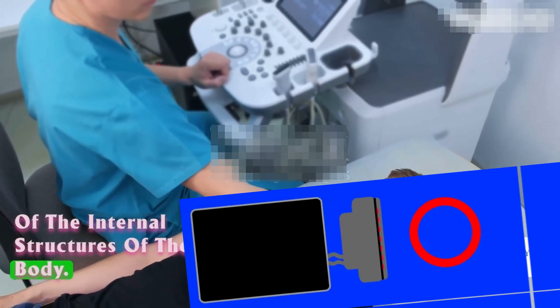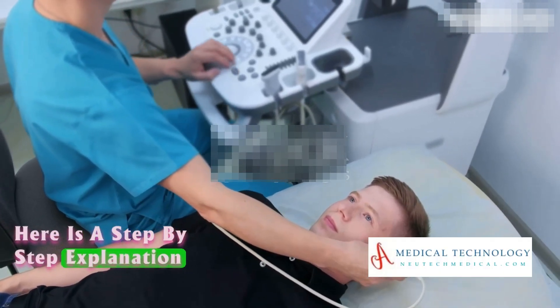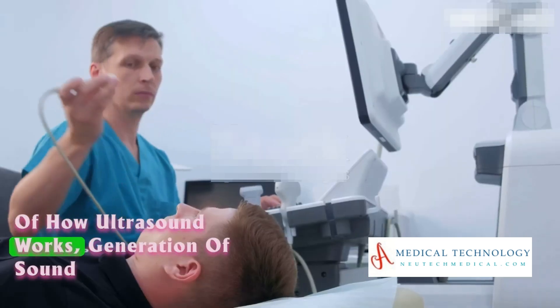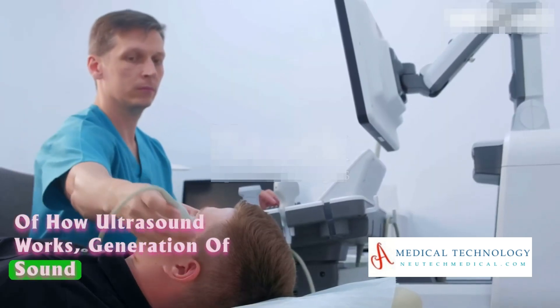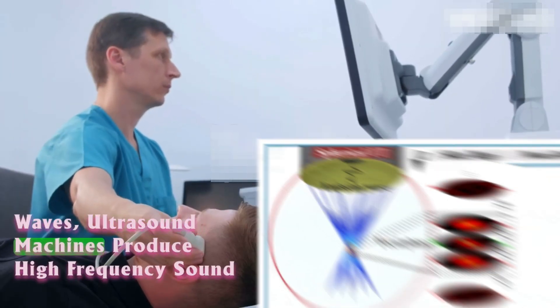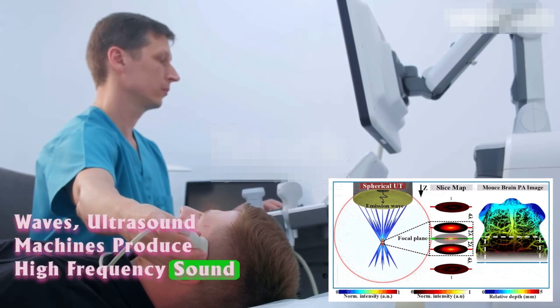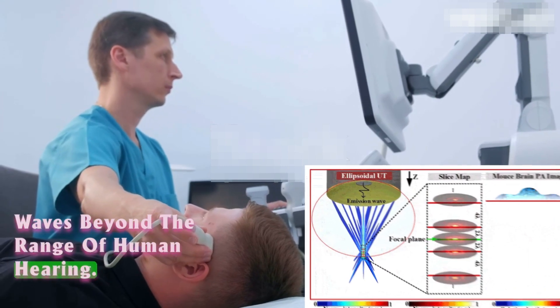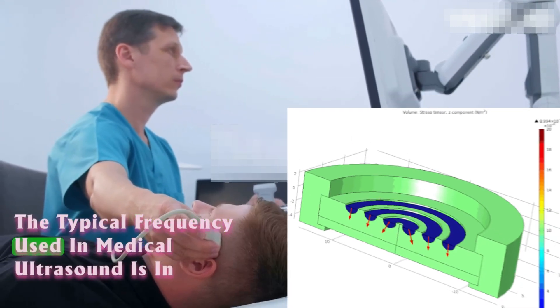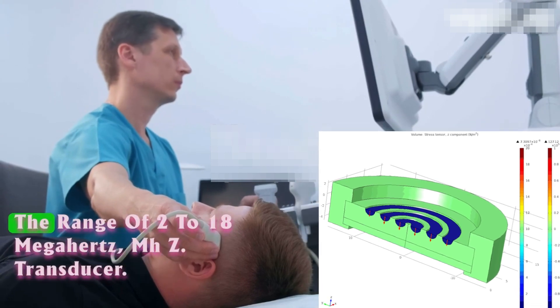The working principle of ultrasound involves the use of high-frequency sound waves to create images of the internal structures of the body. Here is a step-by-step explanation of how ultrasound works. Ultrasound machines produce high-frequency sound waves beyond the range of human hearing, with typical frequencies used in medical ultrasound in the range of 2 to 18 megahertz (MHz).